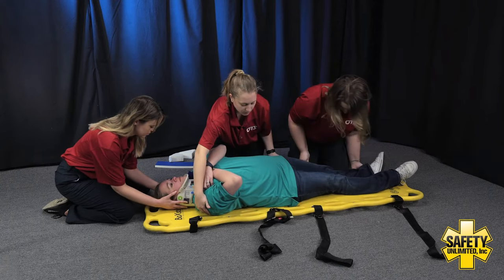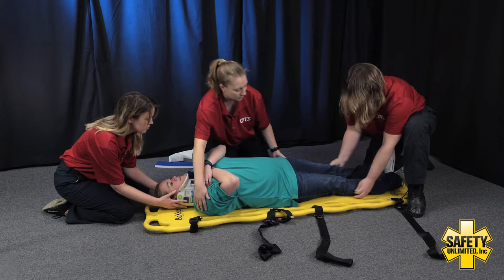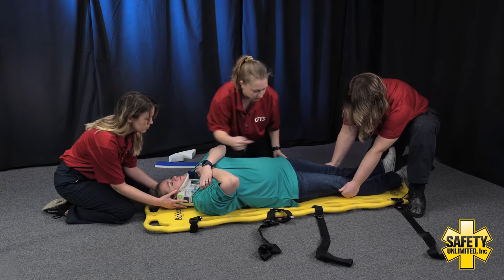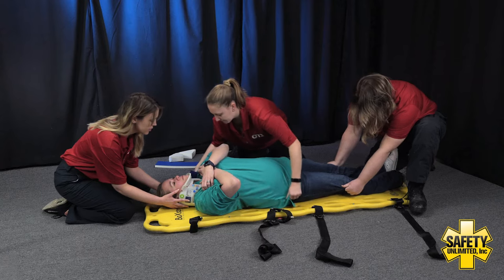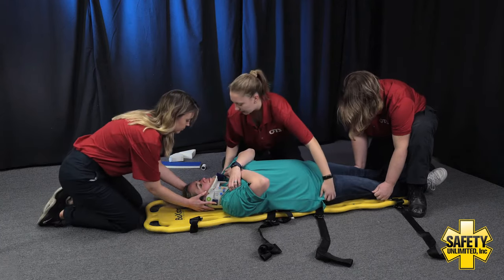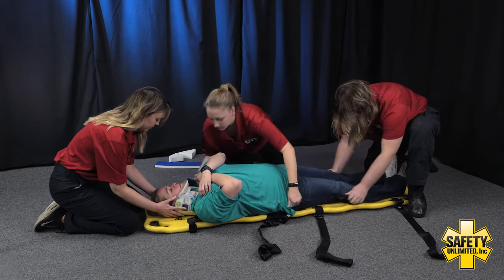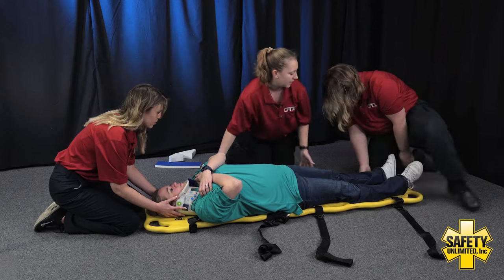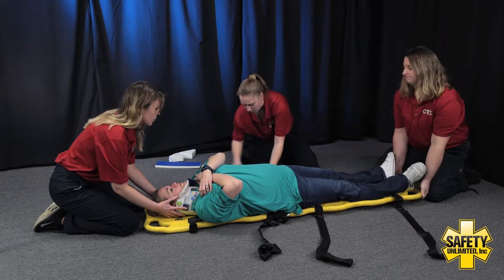From this position we're going to have to do a little bit of a Z drag to get the patient in a better position on the board. On the head's count, we're going to push down towards the board into the patient's right side. On three — one, two, three. And on the head's count, we're going to go straight up on the board to get back into position. On three — one, two, three. Now I'm going to have my EMT assistant lift the bottom portion of the board so I can pull all the straps out.